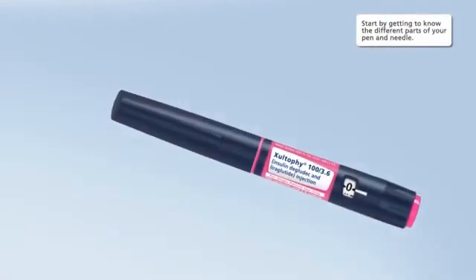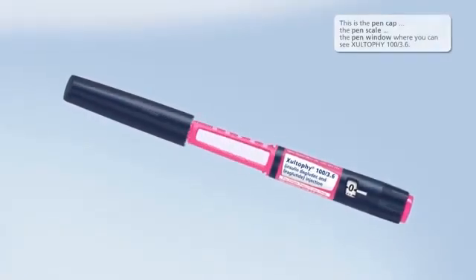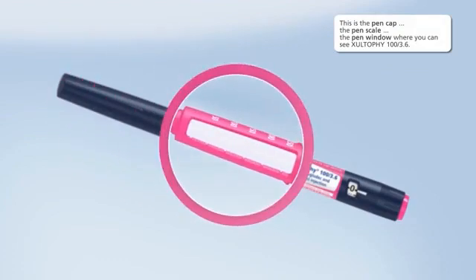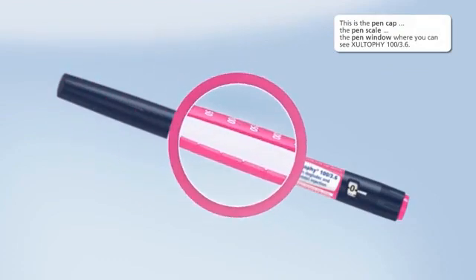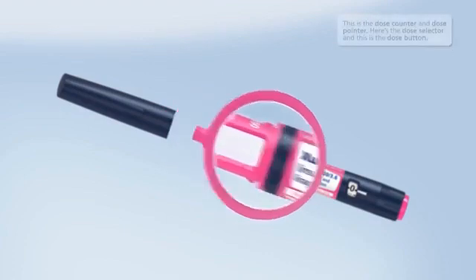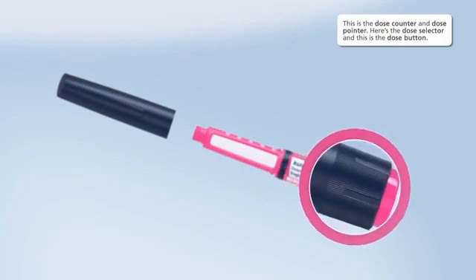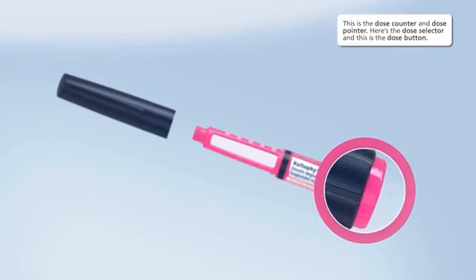Start by getting to know the different parts of your pen and needle. This is the pen cap, the pen scale, the pen window where you can see Zultify 100 3.6. This is the dose counter and dose pointer. Here's the dose selector, and this is the dose button.